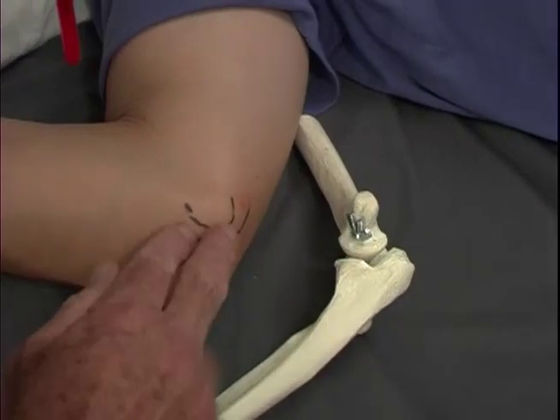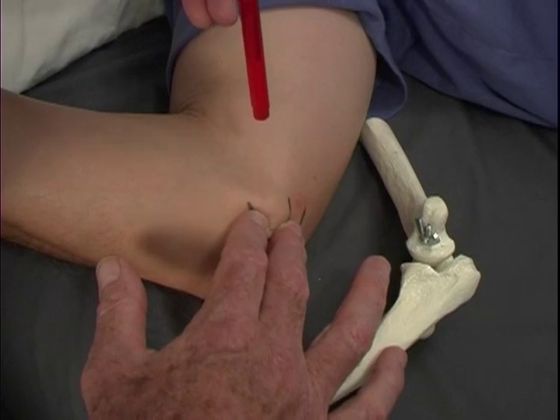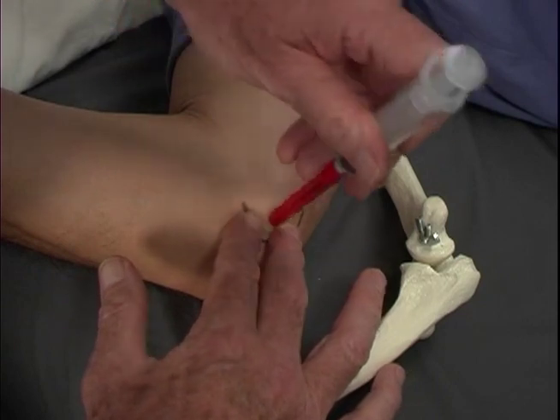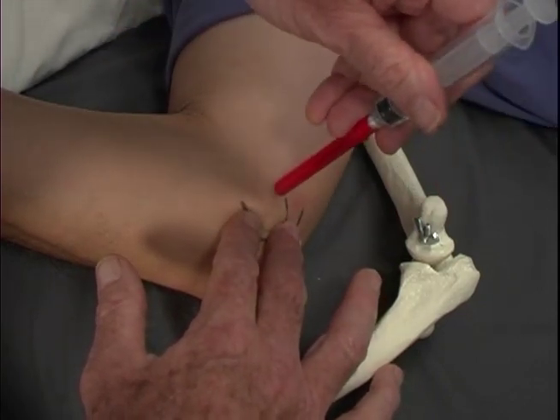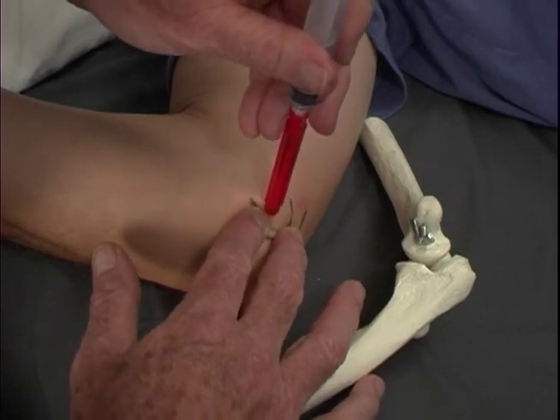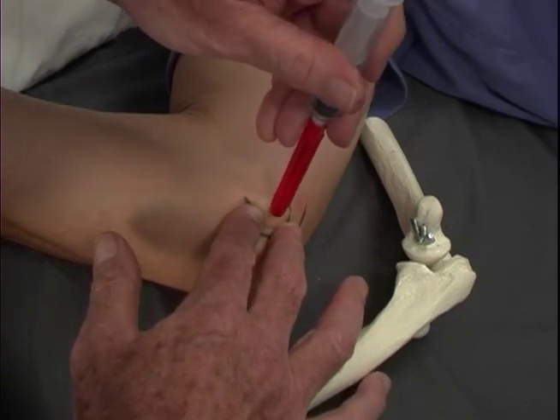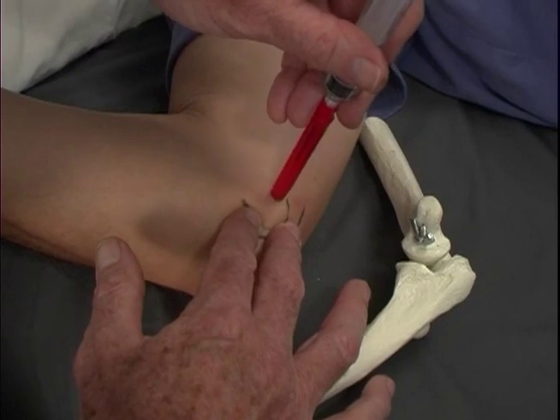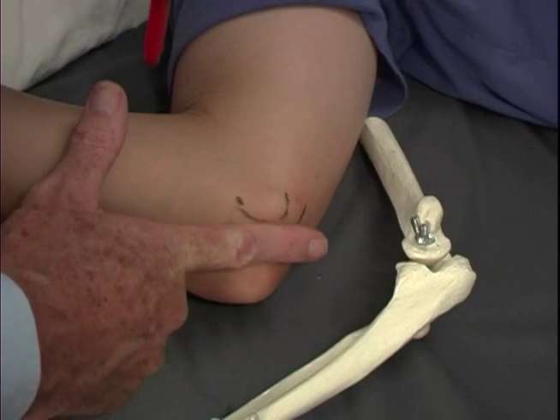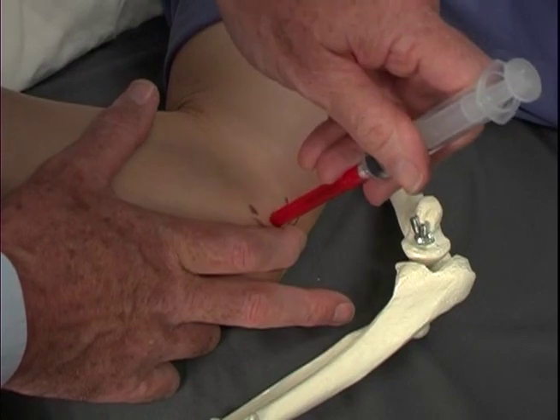So we would do that by holding our fingers in the groove, and this way we're locking the medial epicondyle in our fingers as well, and we can come right down onto it safely and inject the epicondyle itself. It's very important again to find those little tender areas, and they'll often be very small areas, and be sure that you inject them very thoroughly around that medial epicondyle. Once again, we want to stay out of that groove, so keeping our finger in the groove is a good way to avoid that.